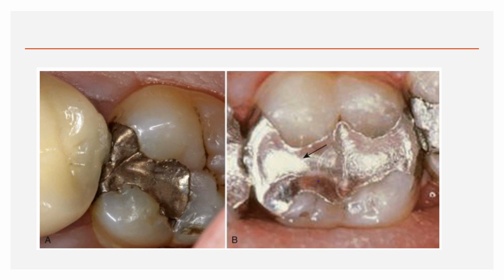You might see a lot of other conditions, but these are some of the conditions you can see in composite and amalgam restorations. When you are doing a clinical evaluation, you have to check the margins and contours. If it is not done properly, it has to be replaced with a new one.